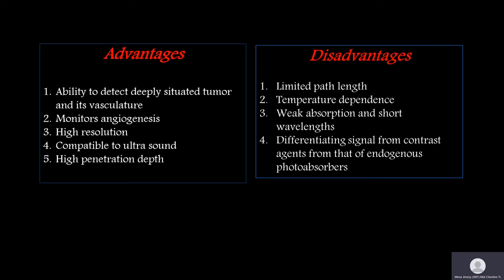One of the advantages of photoacoustic imaging is that it's a suitable screening technique because it uses non-ionizing radiation to image tissues in real time, avoiding any harmful ionizing radiation, and at the same time it still uses hemoglobin and melanin as natural contrast. We can still use any external contrast if we like in different specialties, but mainly in GI surgery we depend on hemoglobin as natural contrast.